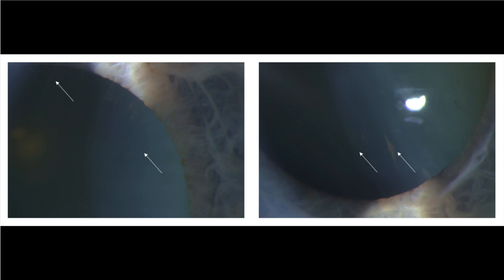In order to overcome this, one typical technique is to create a smaller capsulorrhexis than usual. This could range in size from 3.5 mm to 4.5 mm, and I'll show an example of that in the upcoming case.